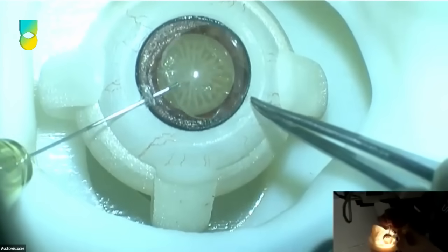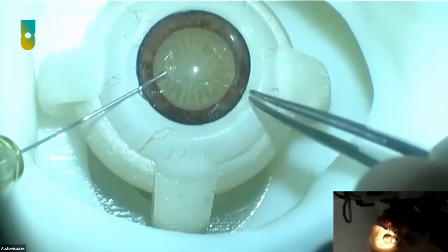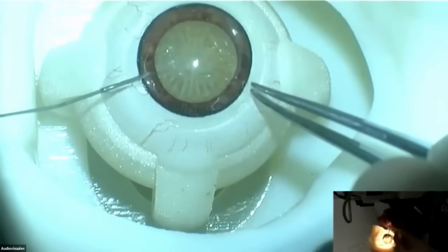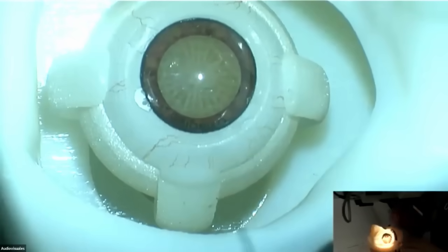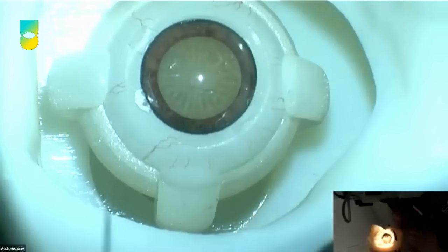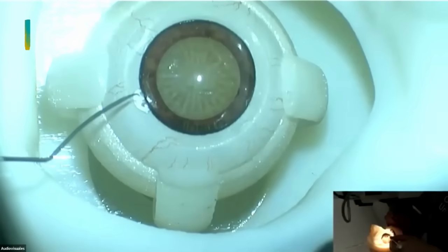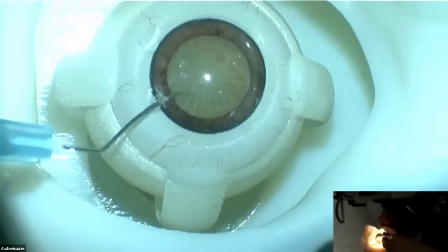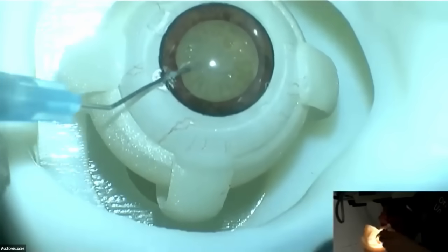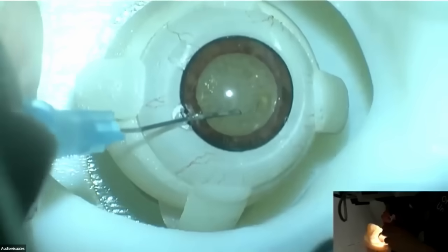Perfect, perfect. Ashley, your thoughts on these concepts? Yeah, I think this is extremely important that, whenever we think of doing something in real life, it becomes so much more challenging than even practicing in a wet lab. I'll often do what she was simulating here, where I hold the other part of the eye with a forceps just to really stabilize the eye. Because again, it's so important for this part to have it as still as possible and as stable as possible.